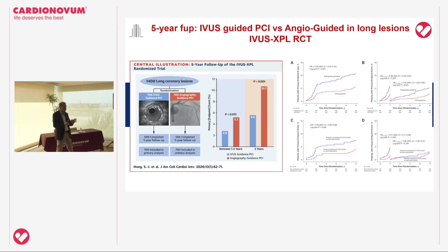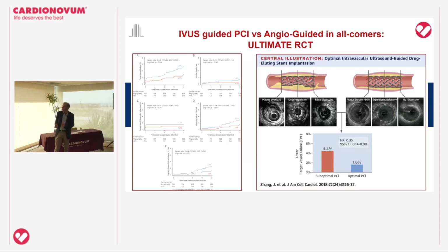It's not just the immediate result, but also long-term follow-up. But again, in those patients with optimal results by IVUS, you end up with better results.